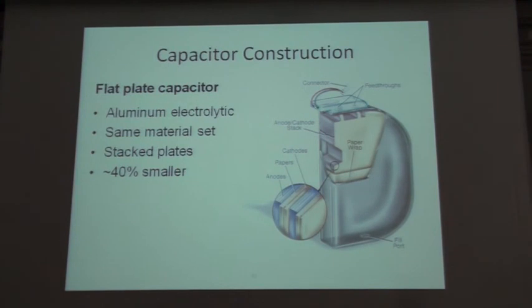At the same time, we could have a much more comfortable shape. We could have the thickness we wanted for the device instead of what the capacitor demanded. And we could round the corners so there wouldn't be sharp points where the edge of the device was.